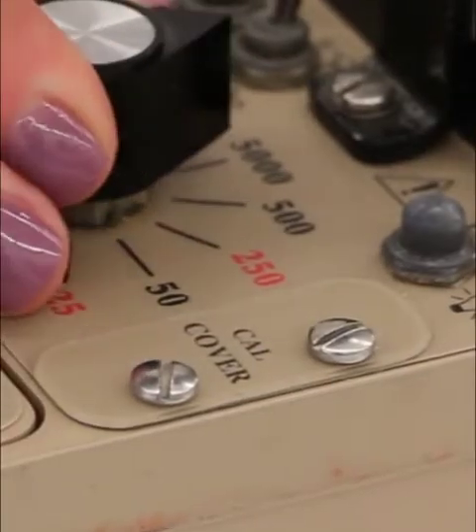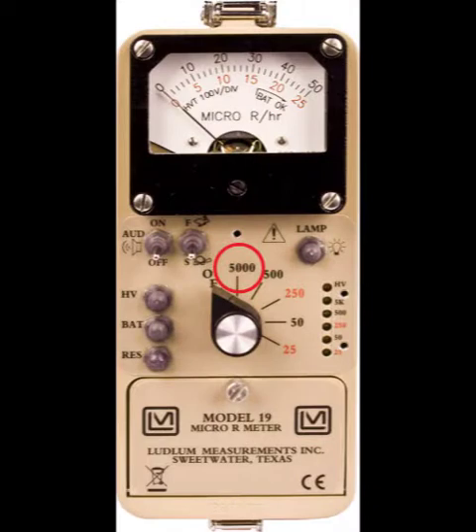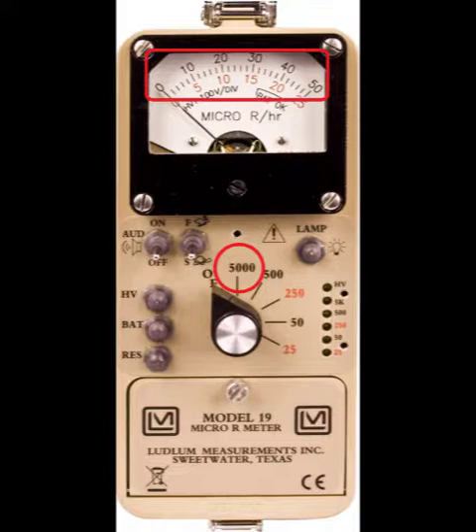The Model 19 is different from most Ludlum meters in that it has ranges instead of multipliers. The first and highest range position is 5,000, which measures from 0 to 5,000 micro-R per hour. You must use the top scale of the meter and add two zeros to the reading — so if the needle points to 40, it is reading 4,000 micro-R per hour on that range. Note that the numbers on the range switch correspond to the color of the numbers on the meter display — black numbers in this instance.